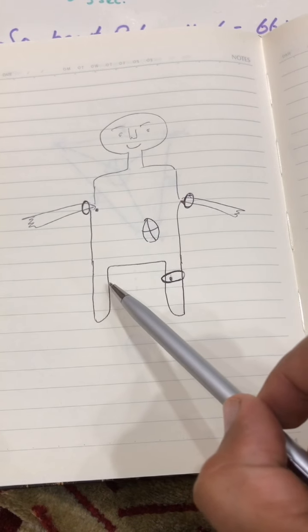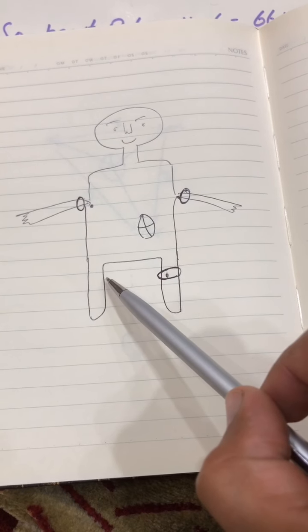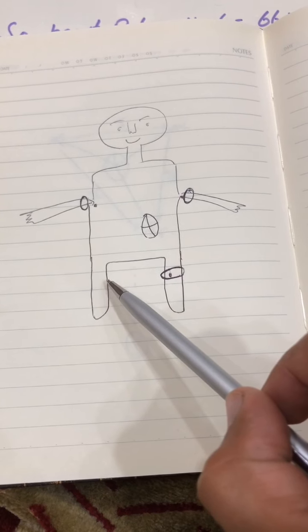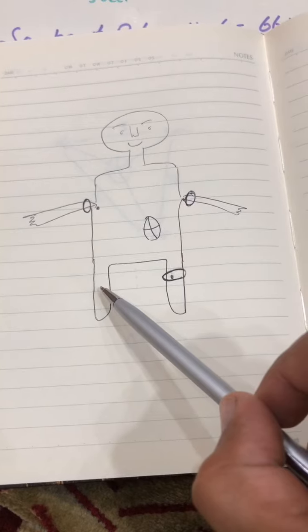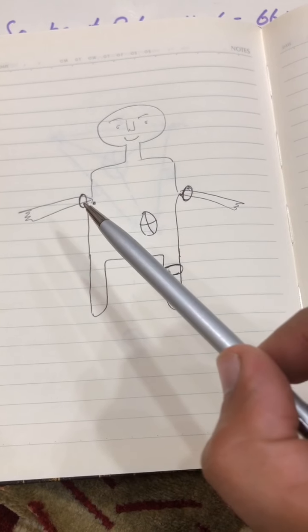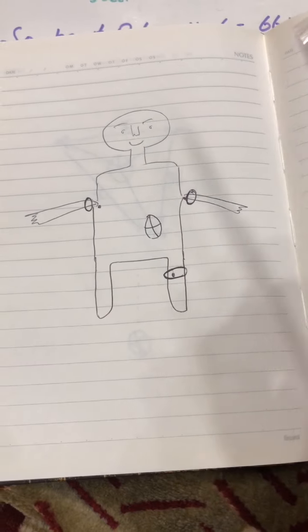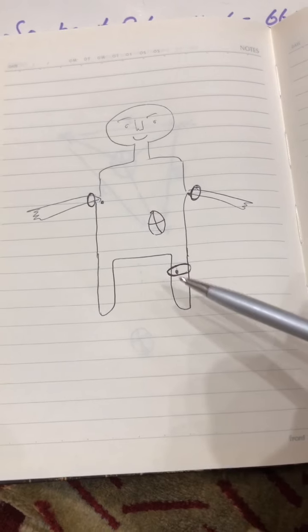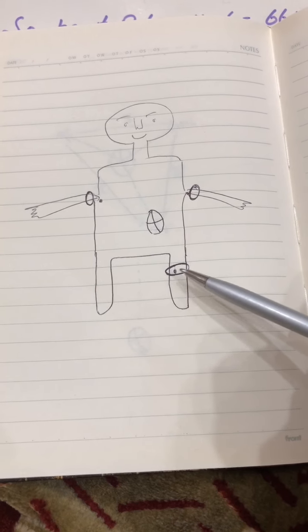But remember, we're not going to talk about the right foot, because the lead connected to the right foot is actually a neutral. Okay, so we can talk about 3 limb leads: right, left, and left foot, or you can say just foot, because whenever you're talking about the foot lead, you're talking about the left foot.